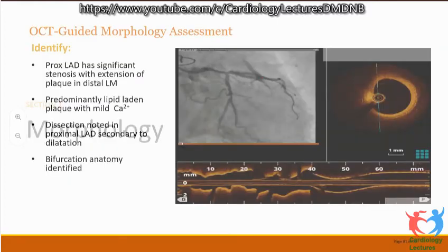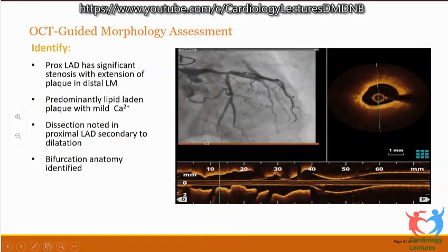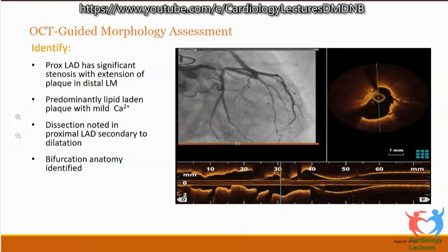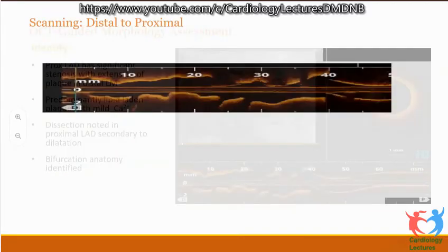So let's look at the anatomy of this. We did angiographic co-registration. This was a run pulled back from the LAD into the left main. It showed LAD disease with mild calcium, and there was also a dissection at the site of the tight lesion. And we also studied the bifurcation anatomy.